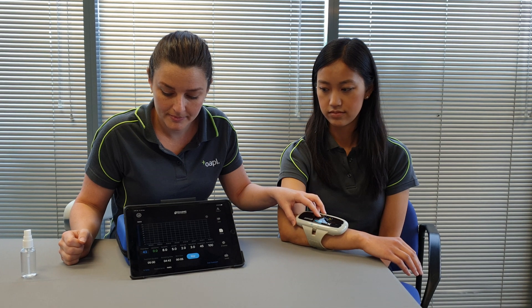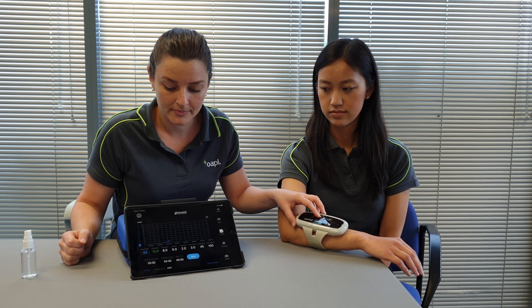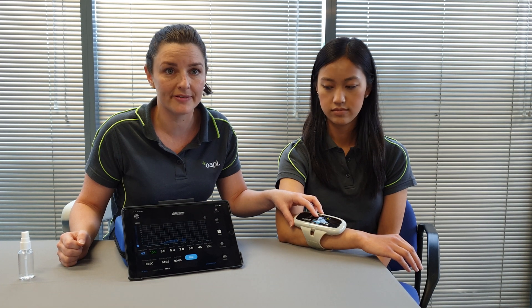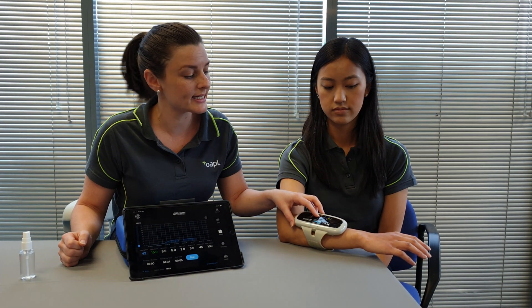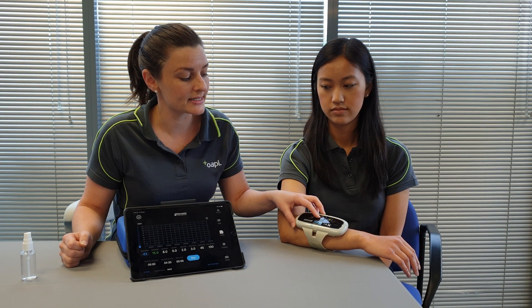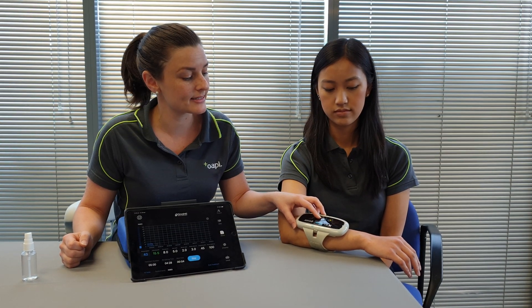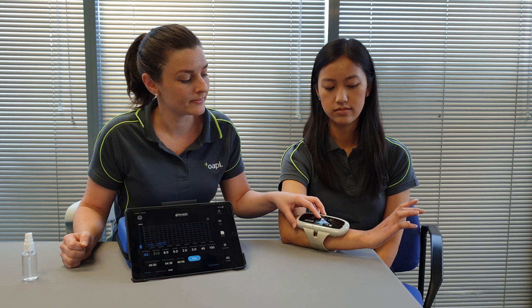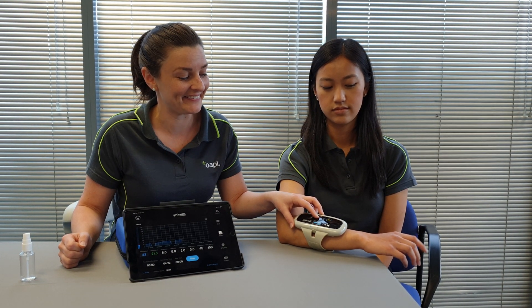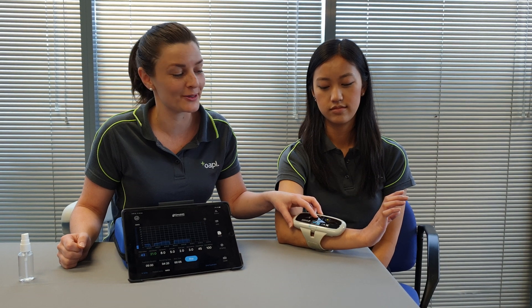Right now you can start to see a little bit of movement in the fingers, and if we increase the intensity a little bit more you'll start to see extension in the wrist — just like that. Anita is not doing anything here; the device is helping her to open the hand.